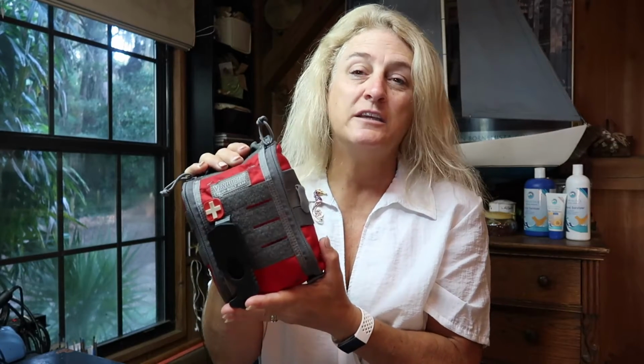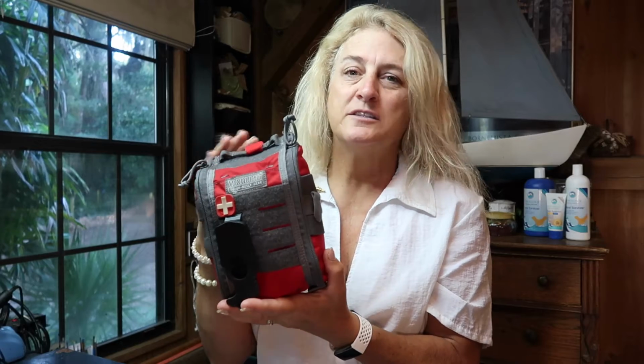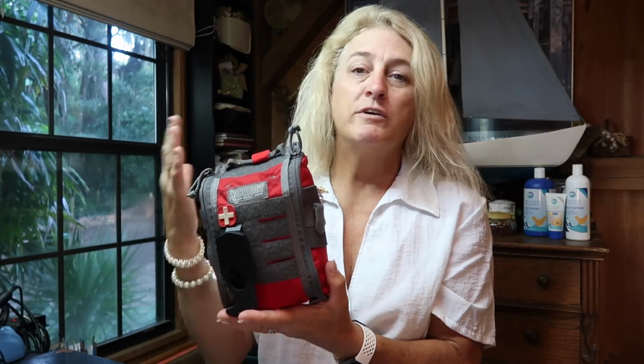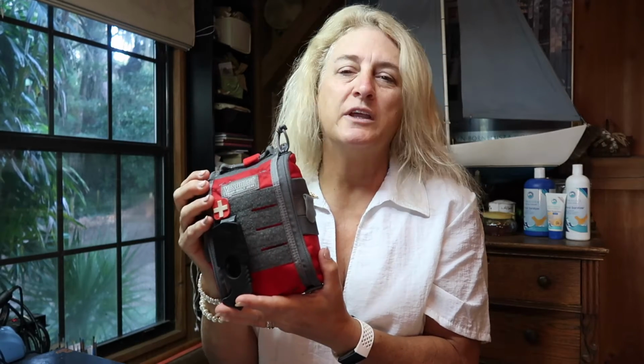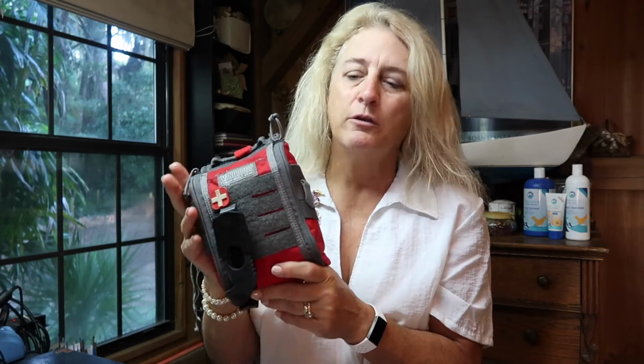This is not a first aid kit. This is not a boo-boo kit. This is simply bleeding control. If someone gets a prop cut and we rescue someone from another boat, or someone gets a big gouge in them and we need to stop the bleeding, this is what I'm going to go for. I'm not going to go for Band-Aids.